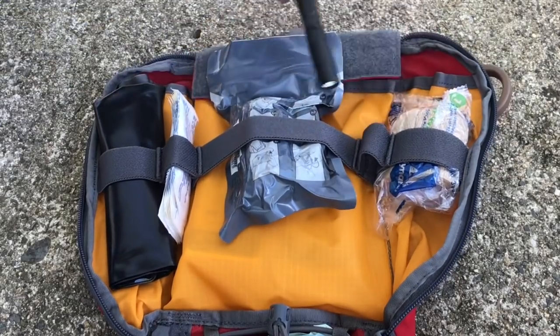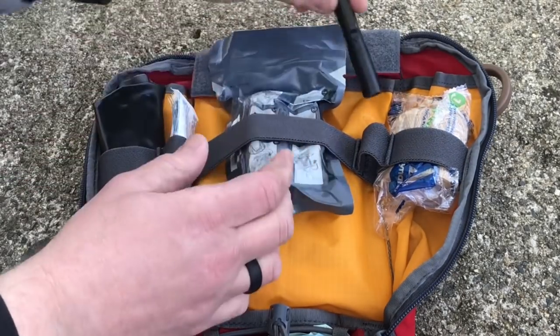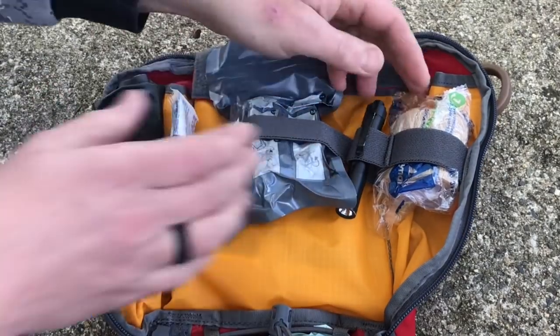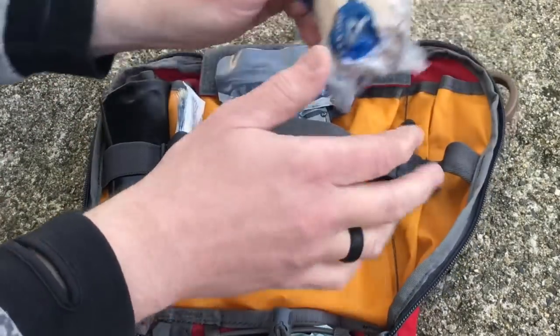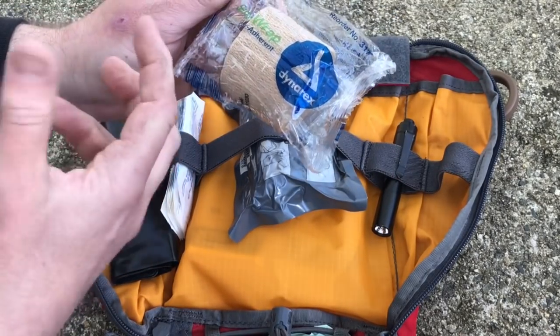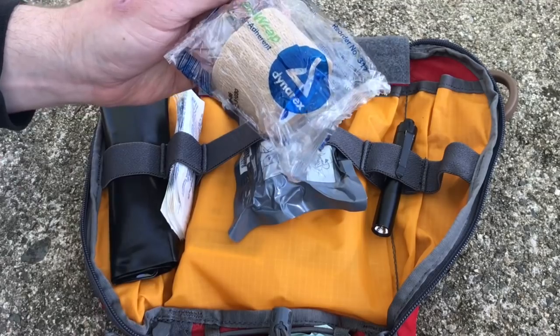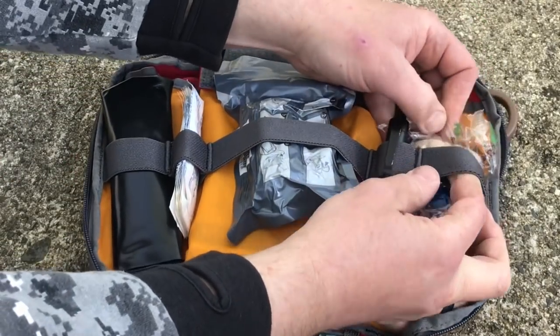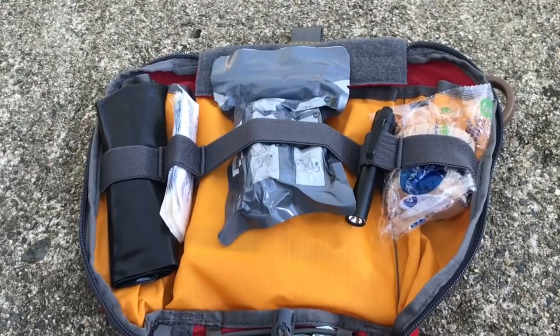Over here I've got a very small flashlight — the Thrunite TI5 — in case I need to see something while dealing with a medical situation. And then over here I've got a roll of Sensi Wrap. This is self-adherent, so it sticks to itself. If you get a bruise or a sprain you can wrap something up, and you can obviously use that in a variety of different ways.